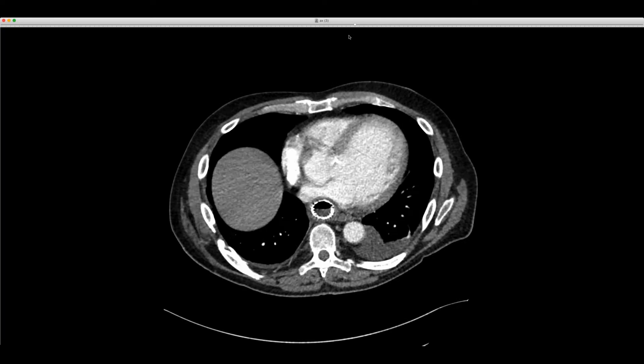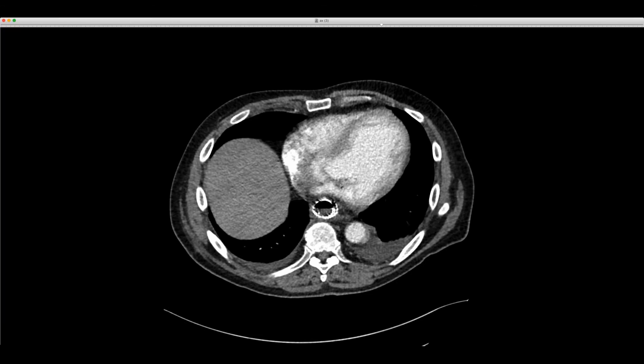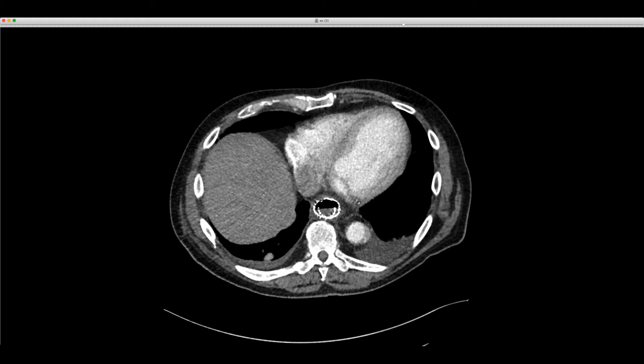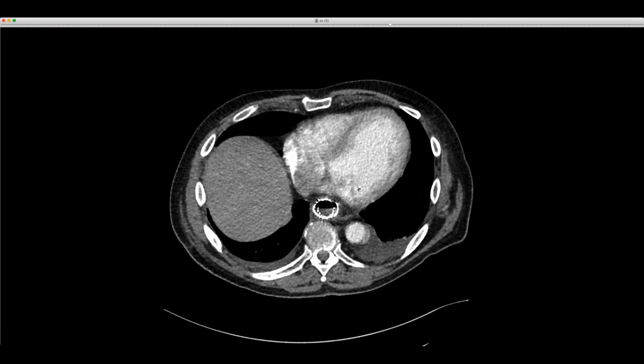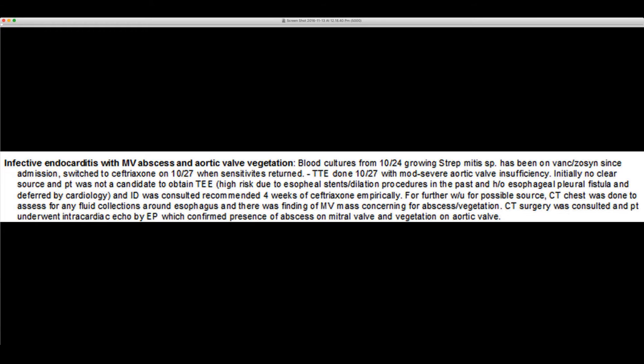A chest CT was subsequently done looking for any infected collection in the chest. As I was reading this, I noticed the mitral valve doesn't look normal — you can see that the anterior leaflet of the mitral valve is thickened and there's a globular area of low attenuation along it. This is much more than can be explained by motion alone. Here's the posterior leaflet. We suspected this patient's source may be the anterior leaflet of the mitral valve. Trans-esophageal echo could not be done because of the stent.